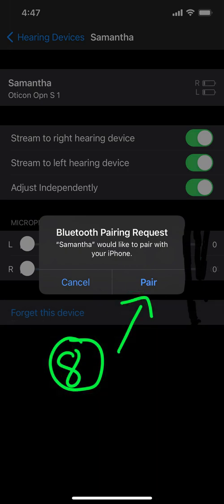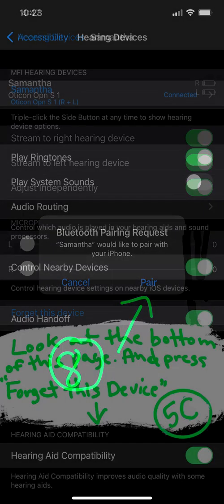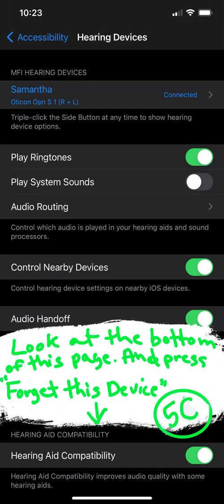Number seven: touch 'Pair' for the first hearing device. Number eight: touch 'Pair' again for the second hearing device. This will take us back to where your hearing aids are found.